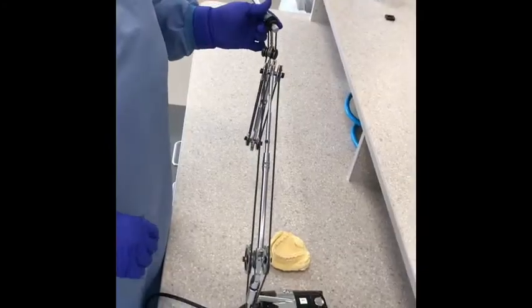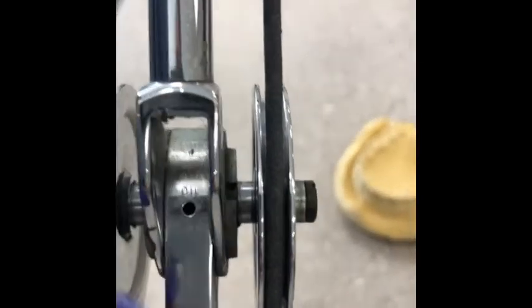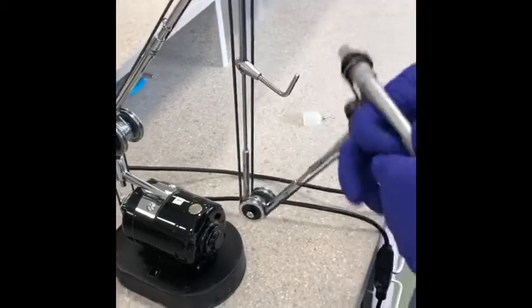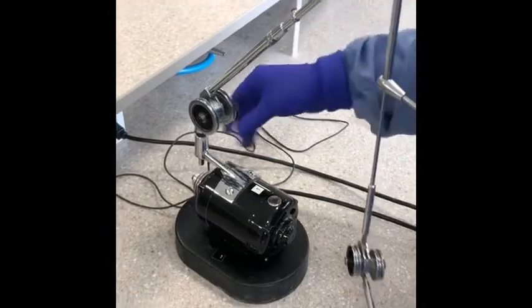Okay, so after you are done using the handpiece, there's always maintenance that has to be done on them. There's a couple areas we do need to put oil to just make sure it's working properly. So this spot right there on that joint, and then down in the hole right there in that joint. Okay, the last thing is I'm going to show you guys how to take the rope off of here, or the belt. It does detach, so you just remove it from the little joints all the way around.